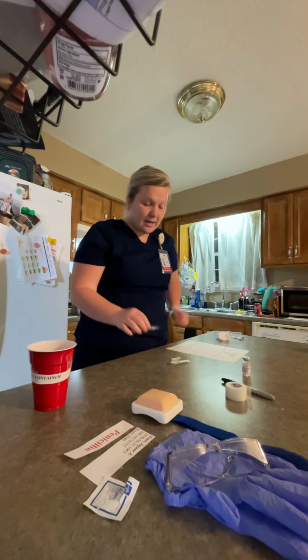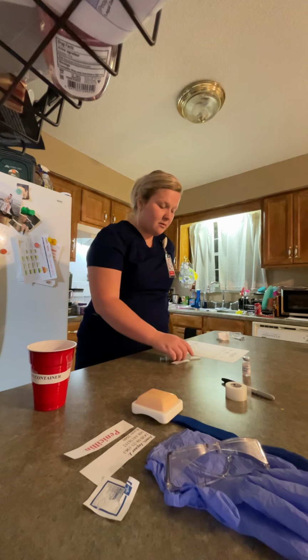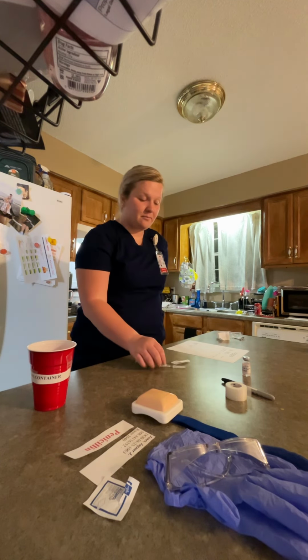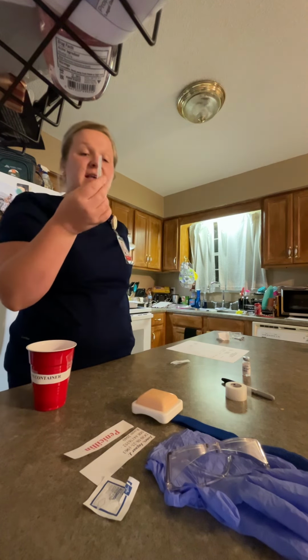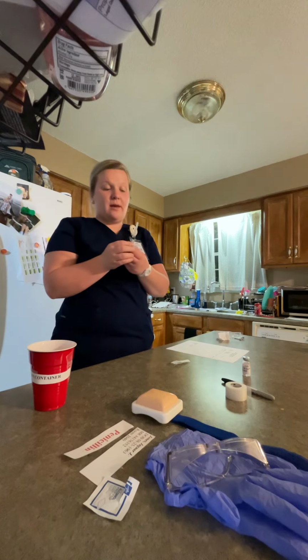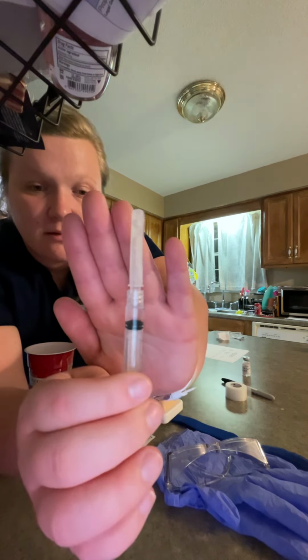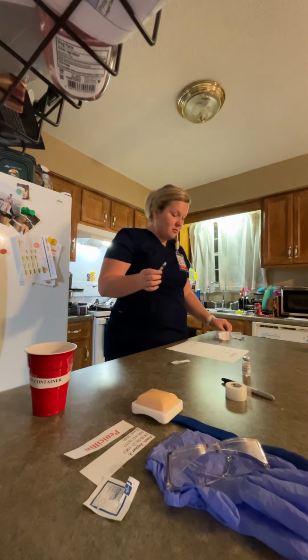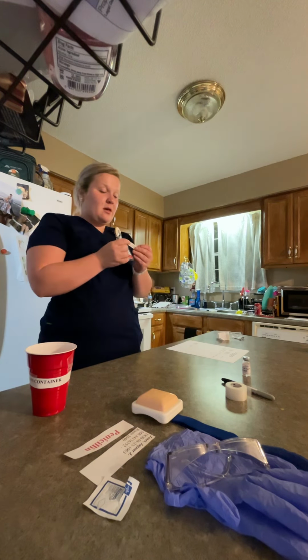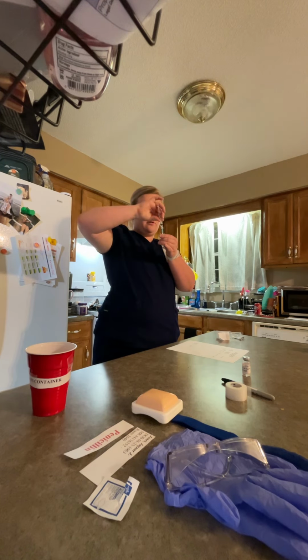Now I'm going to get the top of the blunt tip cannula. Well, I say I am. I can scoop this one up because it has not been in a patient yet, so it is okay to do that. I have to put my needle on. There is my 0.5. Now I'm going to take off the top of the blunt tip cannula, and I'm going to put on my 23 gauge needle.